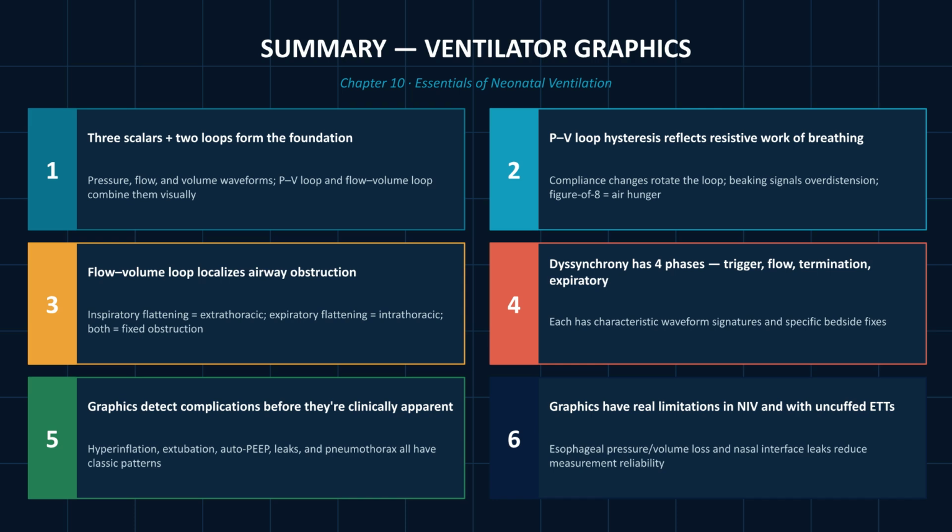In summary, mastering ventilator graphics is essential for neonatal care. By understanding the combination of scalars and loops, monitoring for dyssynchrony, and recognizing the patterns associated with complications like leaks, obstruction, or pneumothorax, you can significantly improve your ability to manage and troubleshoot your patient's ventilation at the bedside.